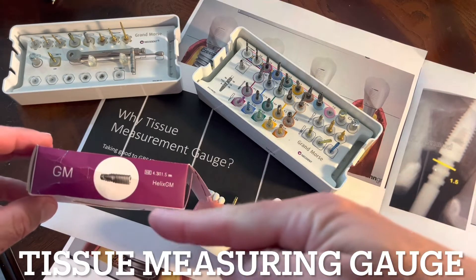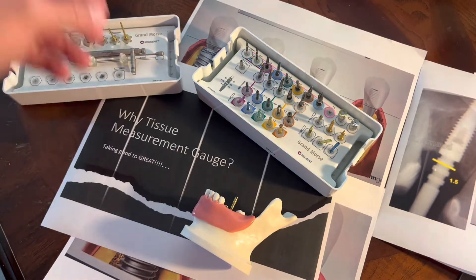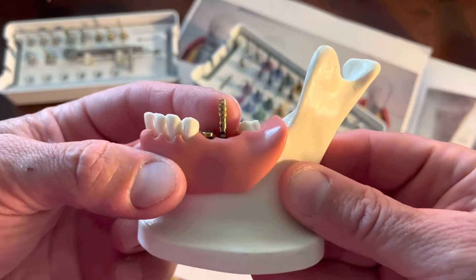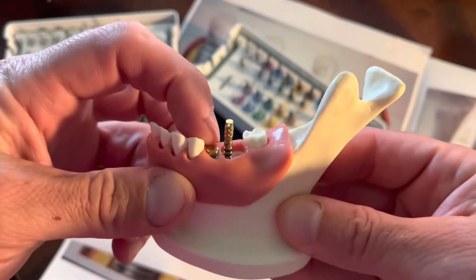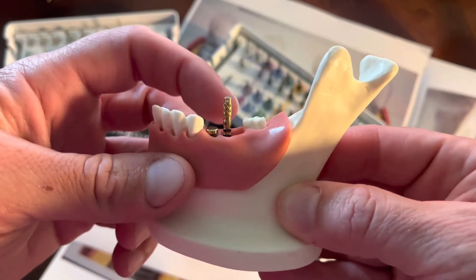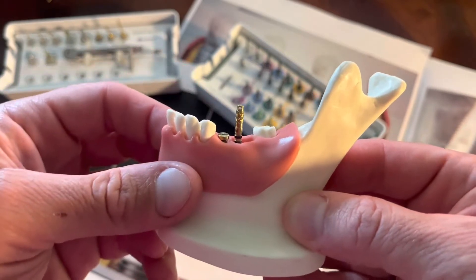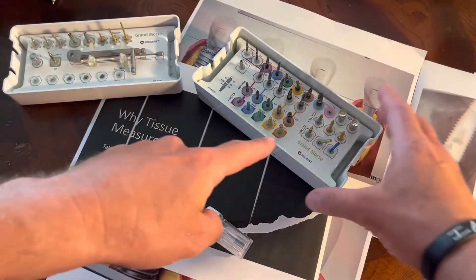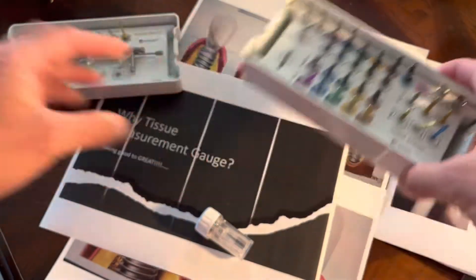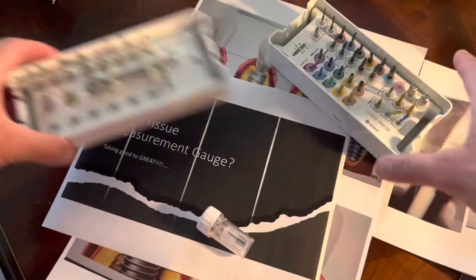We're going to spend just a couple minutes today talking about the Neodent Helix implant being placed and why we use this tissue measurement gauge. One use is for the healing abutment, and the other is during the restoration phase when we put a final abutment in and we want to pick the correct margin. Inside your kits — which some doctors aren't even aware — the tissue measurement gauge is in there, as well as inside your prosthetic kit.